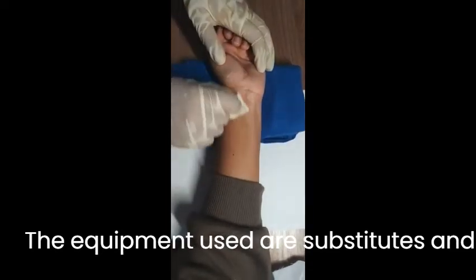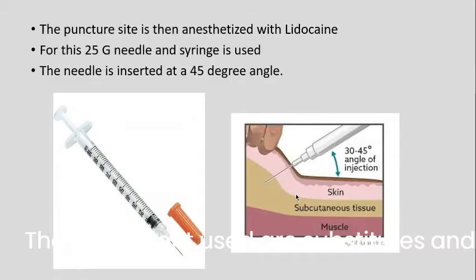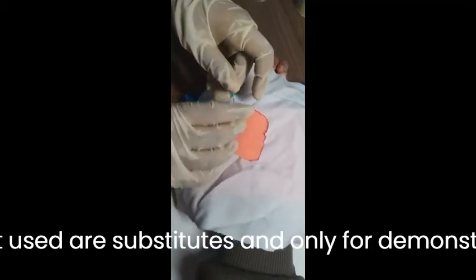Sterilize the area intended for puncture. Palpate the artery intended for puncture. It is then anesthetized with lidocaine. For this, a 25 gauge needle and a syringe are used. The needle is inserted at a 45-degree angle and the lidocaine is slowly injected into the area. Then insert the needle at a 45-degree angle.